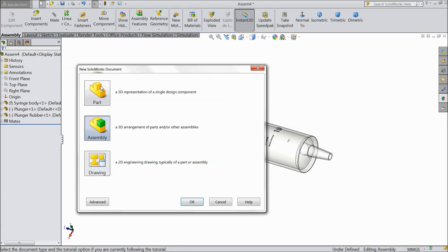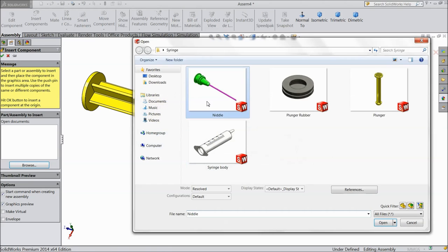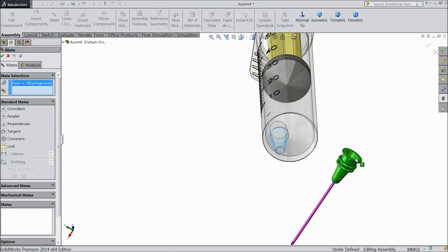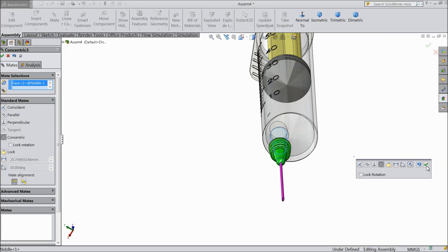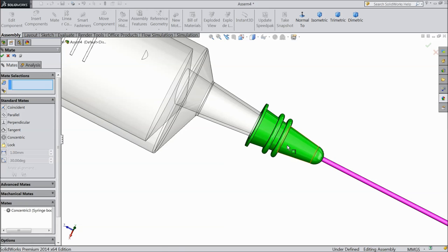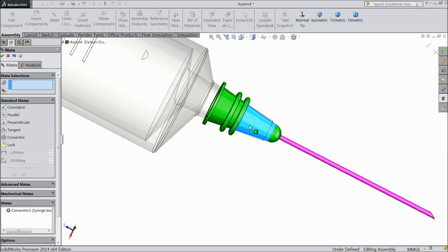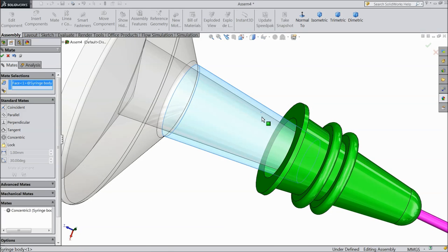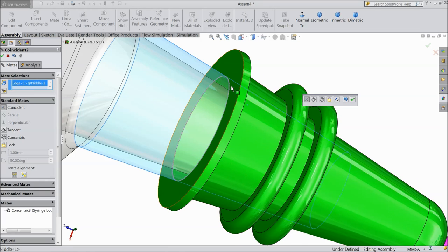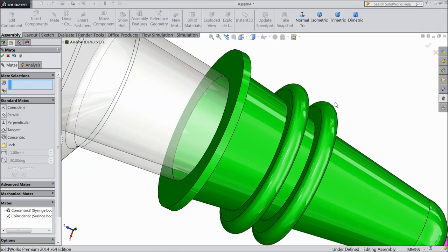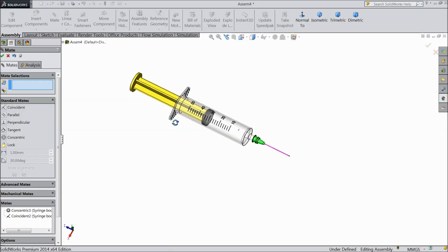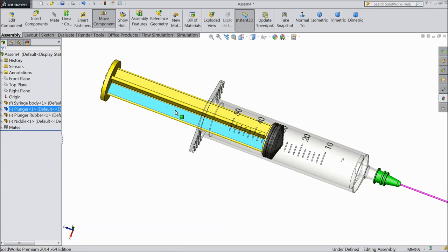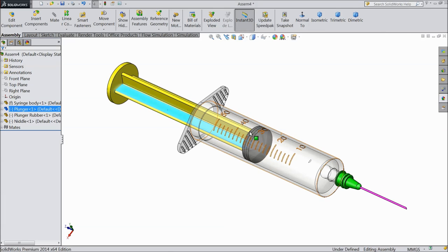Now insert one more component — needle. Now choose mate — select this face and the inside face, reverse direction. Now this time select the upper surface and this edge. See it becomes mated here. So now see our syringe is ready. No need for any other relation. We can make it but I think it's no need — it's looking better. So this is our syringe.